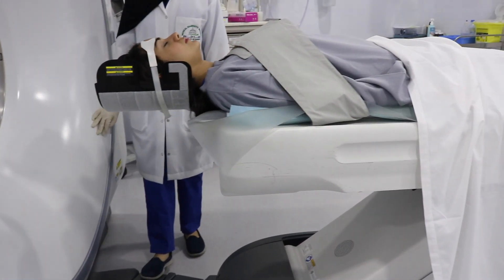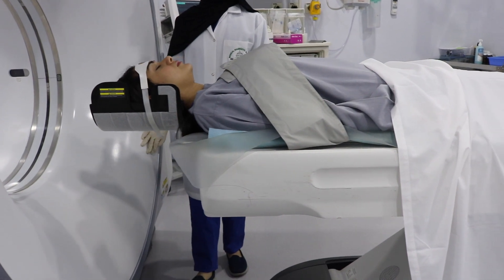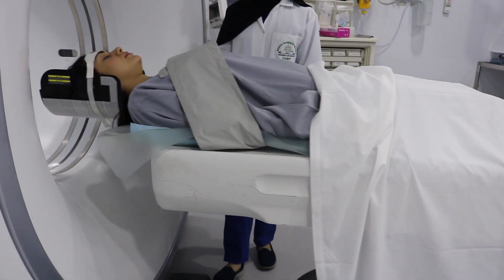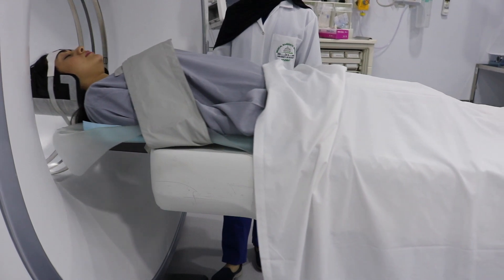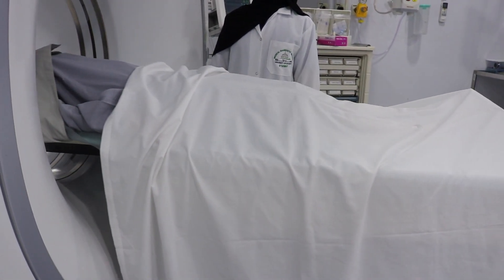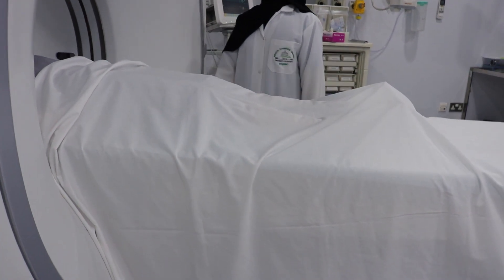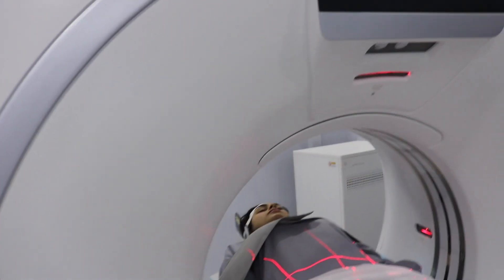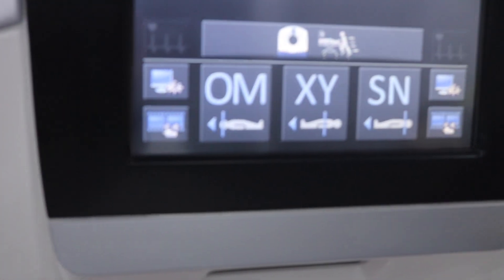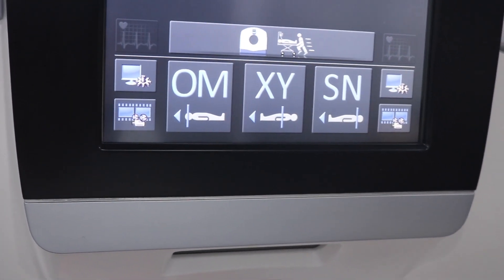As the couch slowly moves through the scanner, the x-ray rotates around your body. It's normal to hear a whizzing or buzzing noise, so you will be asked to stay very still. How long the scan takes will depend on what parts of your body are being examined — it can take anywhere from a few minutes to half an hour.